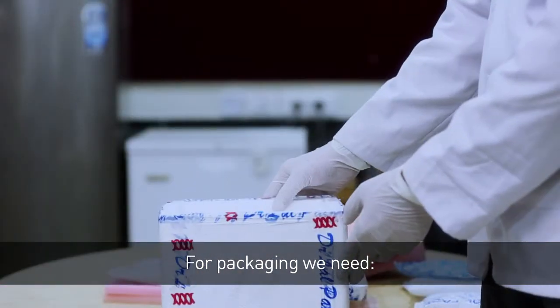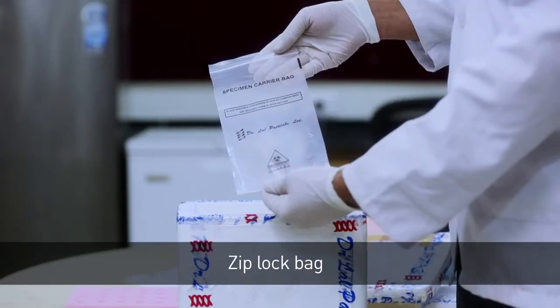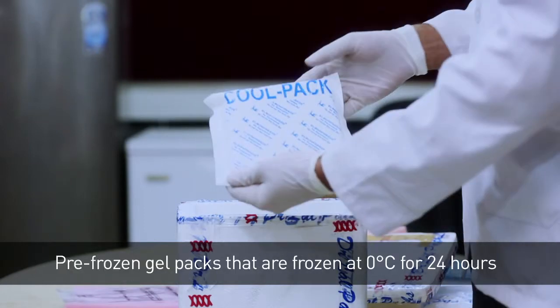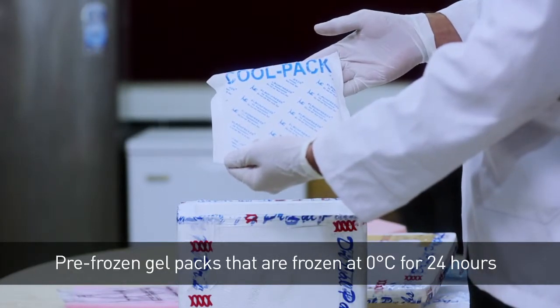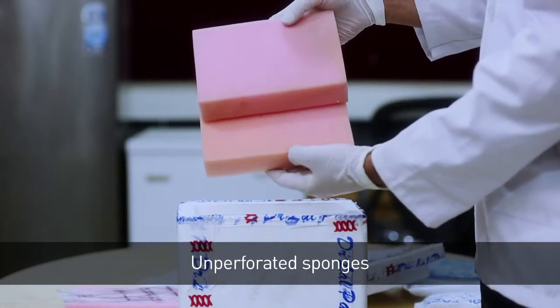For packaging, we need a thermacol box, perforated sponges, a Ziploc bag, pre-frozen gel packs that are frozen at 0 degree Celsius for 24 hours, and unperforated sponges.